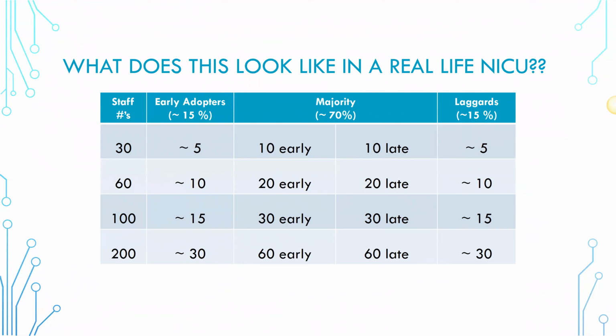There are some other benefits of that. And if you see up here on the left where you see this big temporalis muscle, well, if we were to monitor too far low, we would get a lot of temporalis interference.